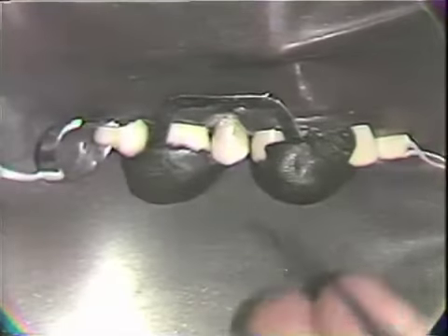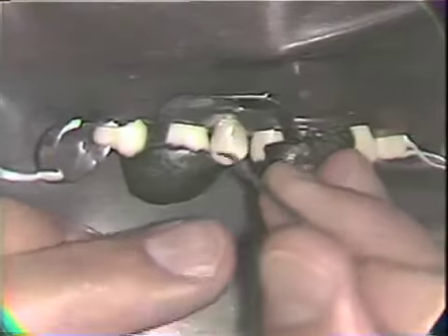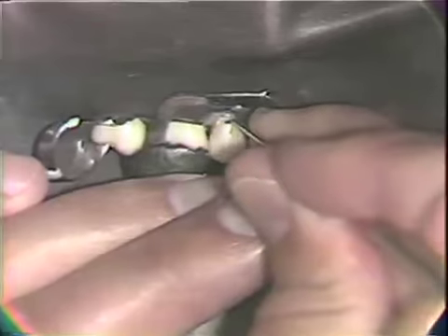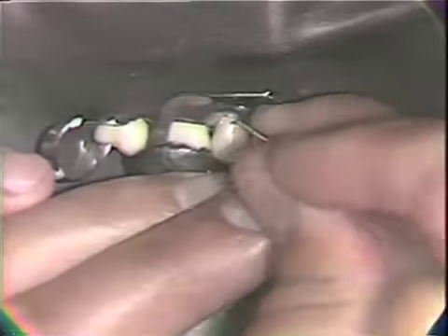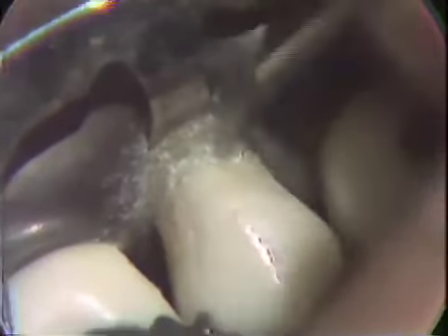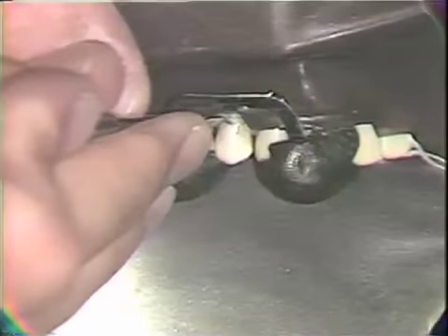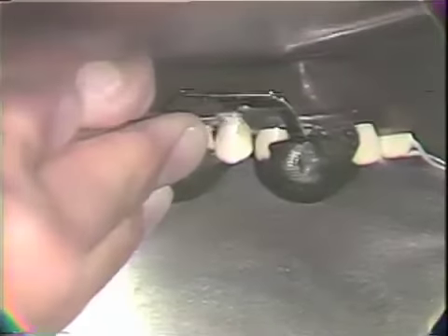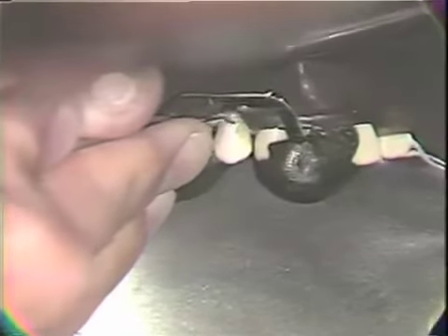Once the retention is completed there, and of course we'll be checking this with an explorer in a moment, we can move on into the same type of retentive form in the cervical, or in the occlusal area in this case, starting in the central area and dragging that instrument across in a mesial direction. And once that retention has been established, starting with it in the central area again and drawing that instrument across in the distal direction.